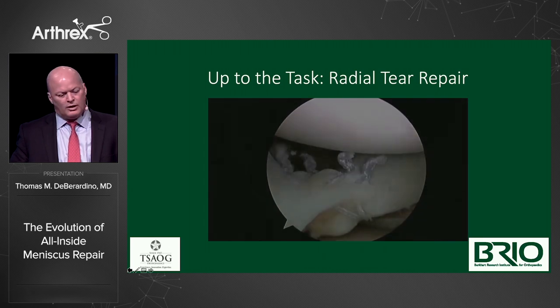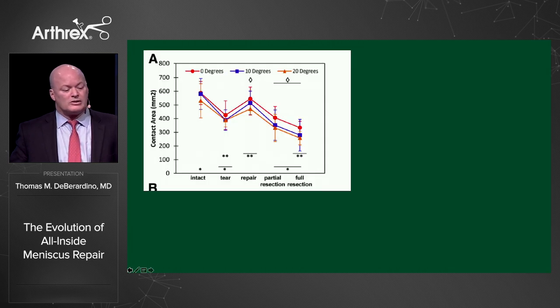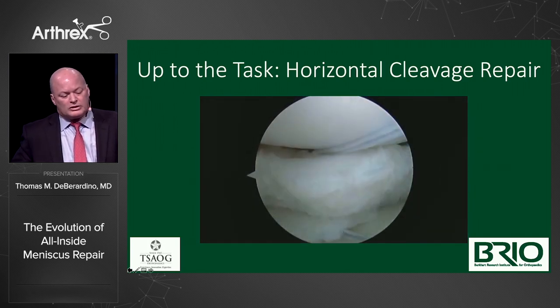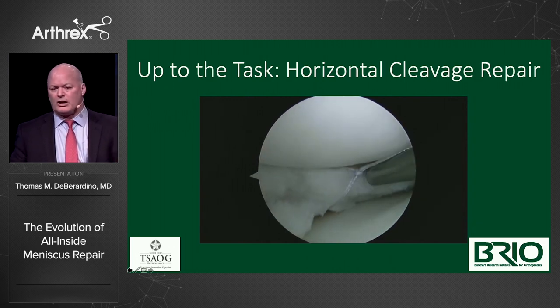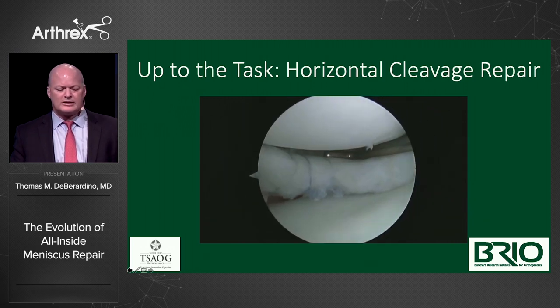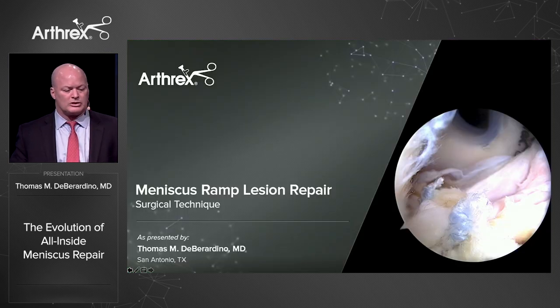Here we are stacking a couple side-by-sides, getting a nice repair. For horizontal cleavage tears, we know from the data that taking it out is not innocuous — it looks better for pictures but we know what it does to contact area. We can restore that if we stabilize the horizontal cleavage tear. In younger patients, try what I call barrel stitches — circumferential wrap-around stitches — and we have a better chance of returning the pressure gradient back to near normal. These often have parameniscal cysts; this shuts down that machinery and keeps the bulk function of the meniscus.